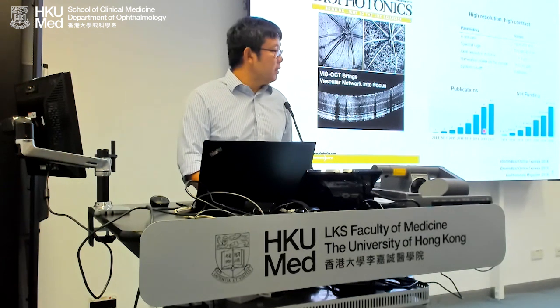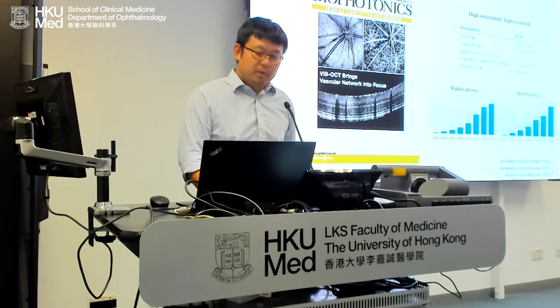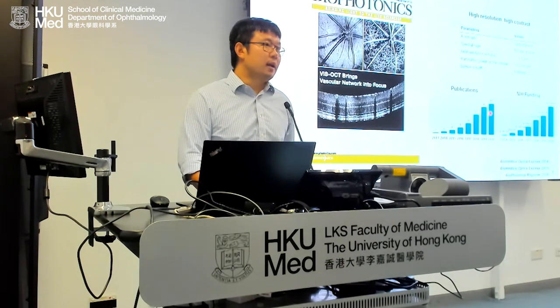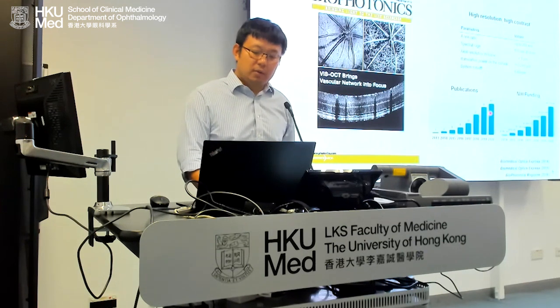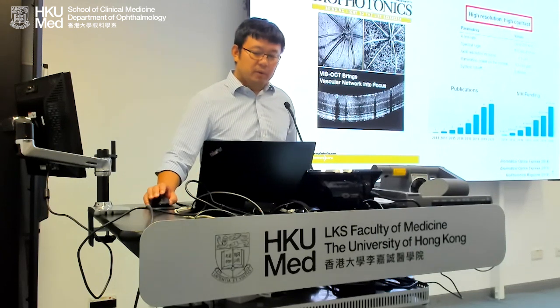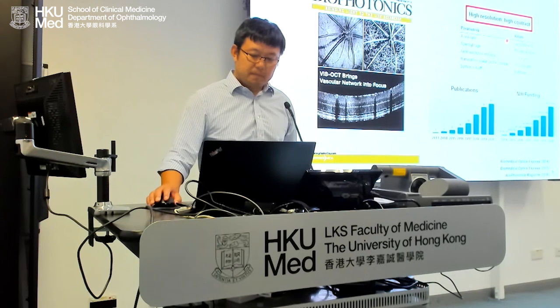In 2013, we published the first paper. And then by 2020, a lot more groups around the world started catching up. These wavelengths introduce two major benefits: high resolution and high contrast. I'll explain what I mean by high resolution and high contrast.